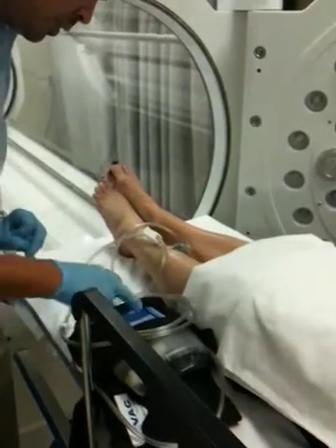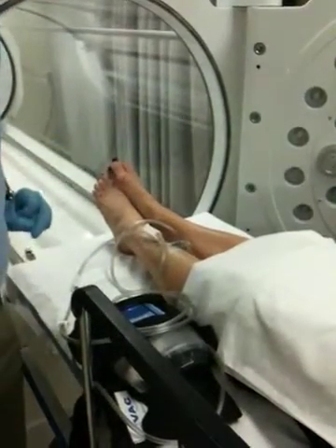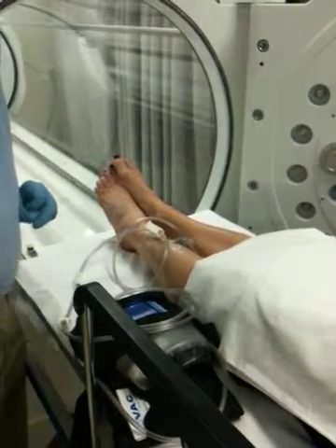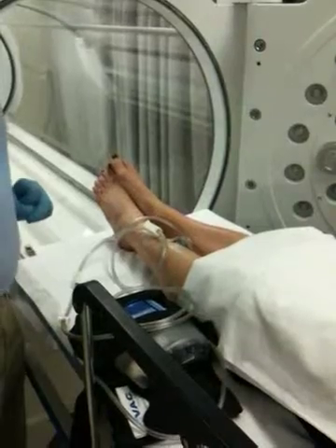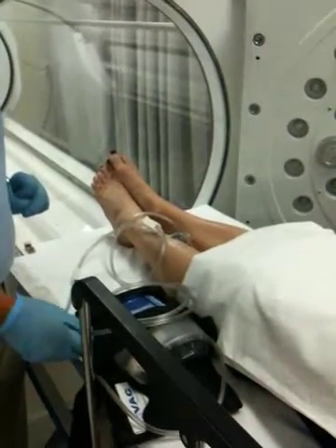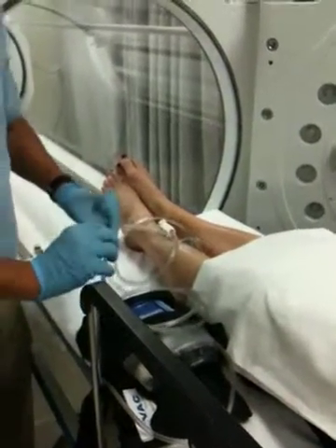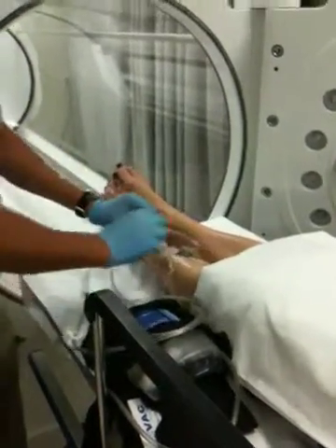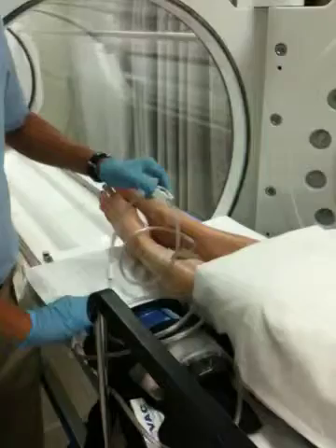Hit therapy on and you should get your pressure that the physician has ordered. Make sure you unclamp these areas as well — that way you can get the perfect pressure.